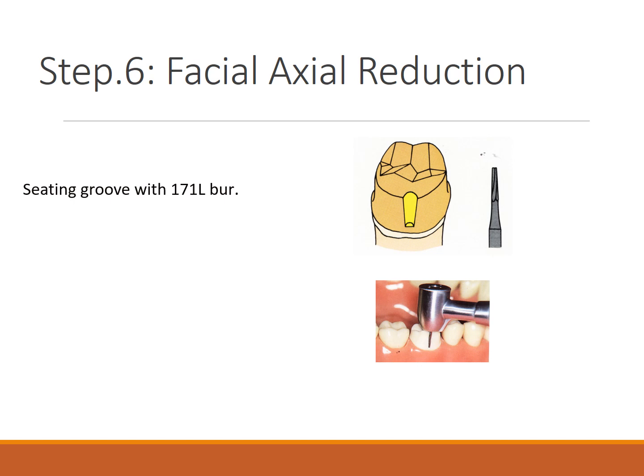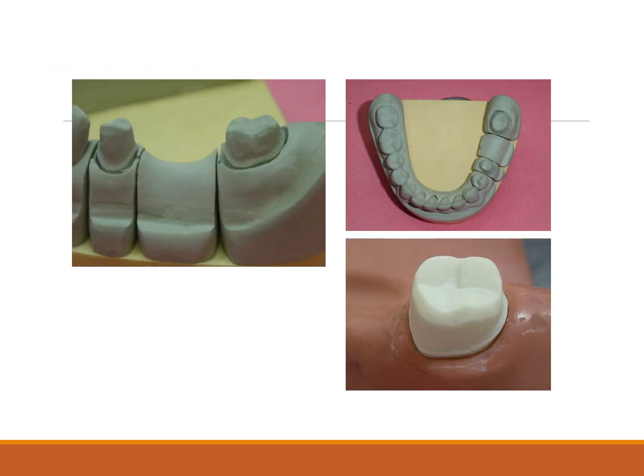You have to give proper finishing lines, and the smoothing should be done well, guys. So these things have to be remembered. I guess that's all, guys. And this is for a bridge preparation, guys.